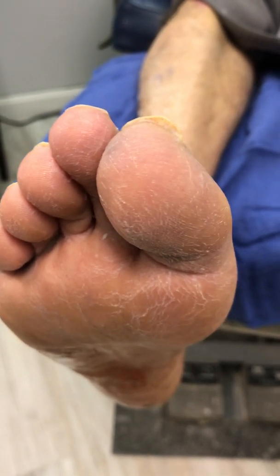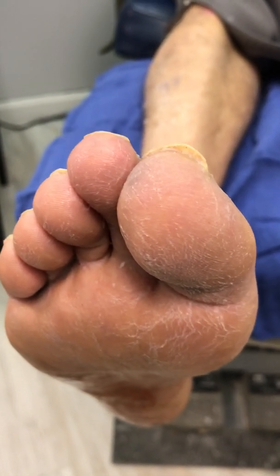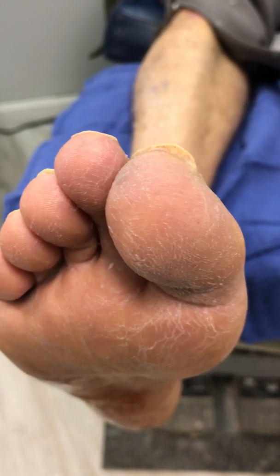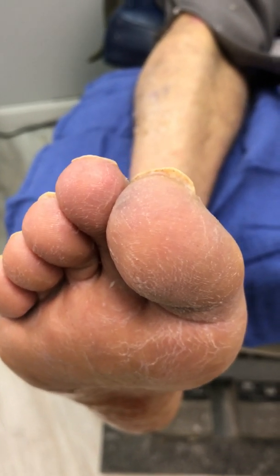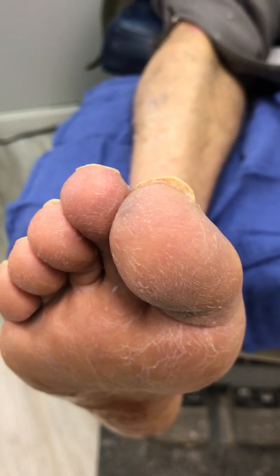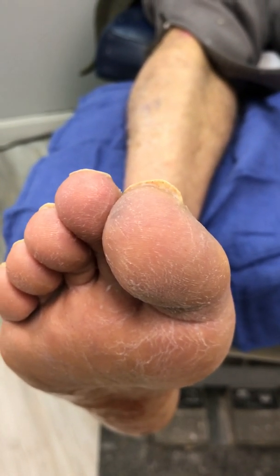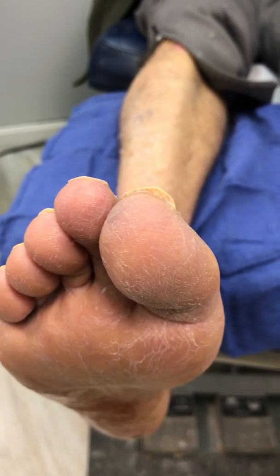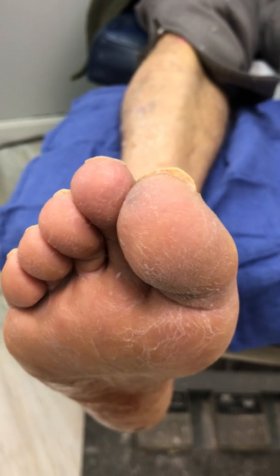In his situation, he had undergone a frontal plane correction, which is a derotation of the heel as a major anomaly of his foot, with some tendon work along the posterior tibial tendon, anastomosing it to the flexor, which did not seem to help him in regards to his symptoms.